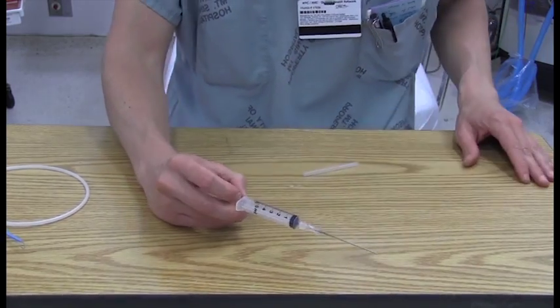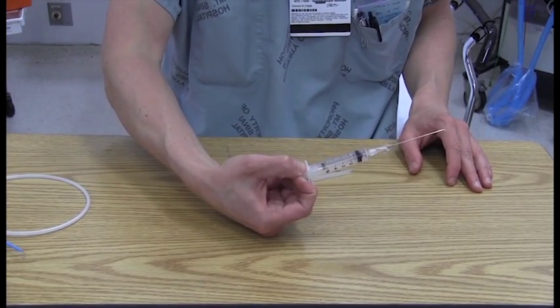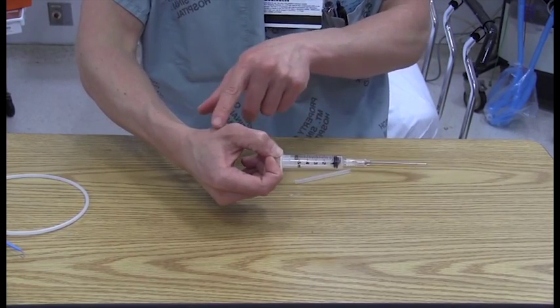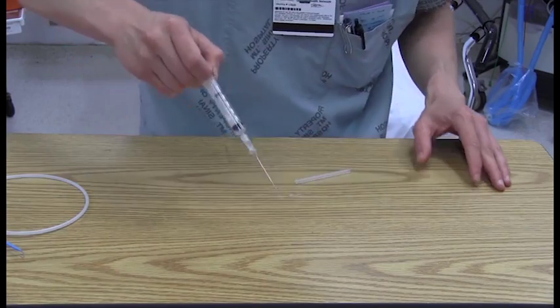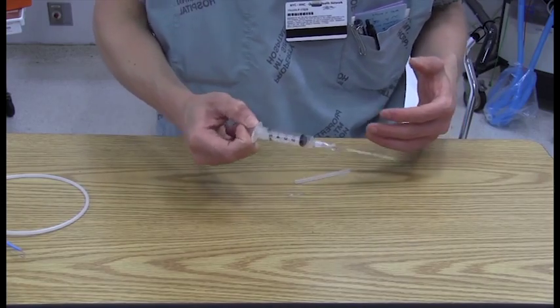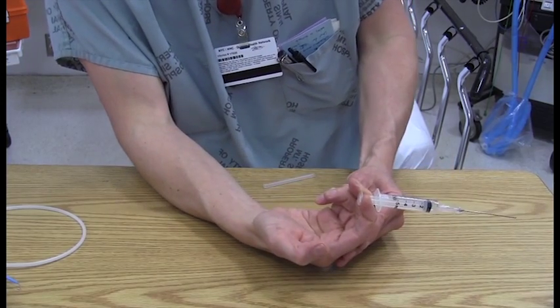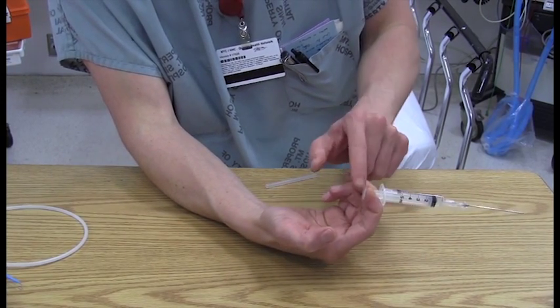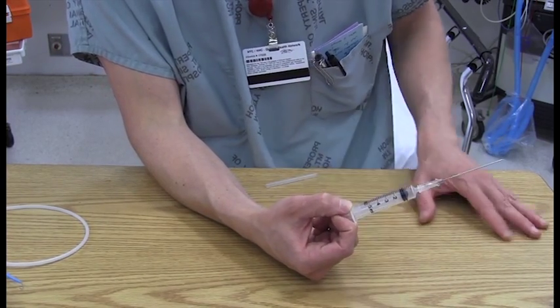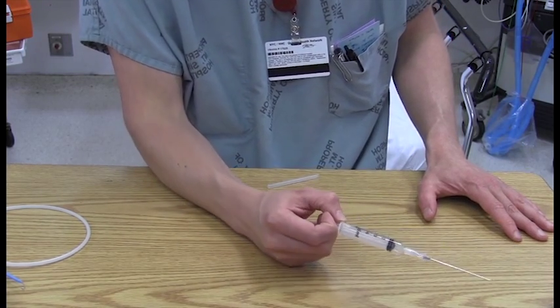So the first micro skill is learning syringe manipulation in the setting of being able to withdraw the plunger back. Because once you enter through the skin during a central line, you're supposed to be exerting constant negative pressure on the plunger. At the same time, you're able to move in and out, change your direction depending on what the ultrasound is showing you. And you have to be able to do that. So the finger motion is index and middle finger on the plunger, and the thumb on the actual extrusion of the syringe itself. There's other ways to do this. This is the way I find to be easiest, but you need to practice and get really good at this.